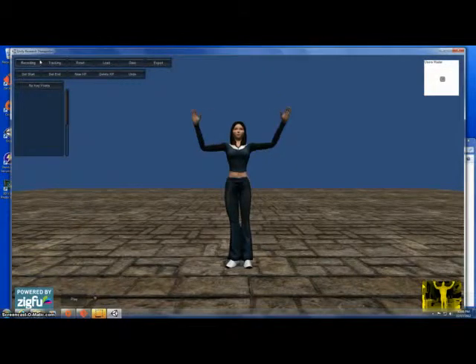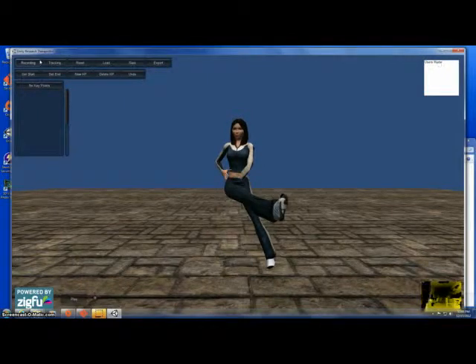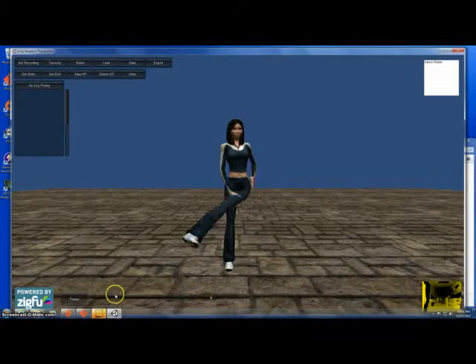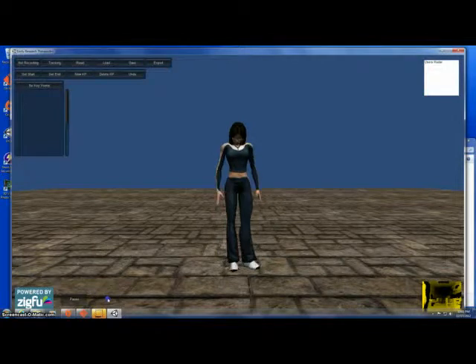When the therapist is finished recording the exercise, they're going to have a chance to crop it. They'll be able to isolate the beginning and end of the exercise using the play and pause button or the scroll bar down at the bottom. And once the exercise is fully cropped, the therapist can add key points to the exercise.